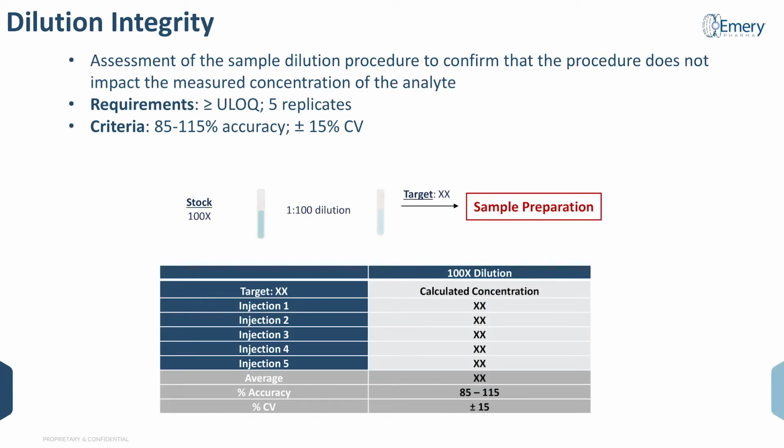As mentioned, anytime you do bioanalysis, you're uncertain of what the analyte concentration may be. As a result, you may need to dilute your sample to have the analyte concentration fall within that linear range. How do you know that the dilution that you do is appropriate?